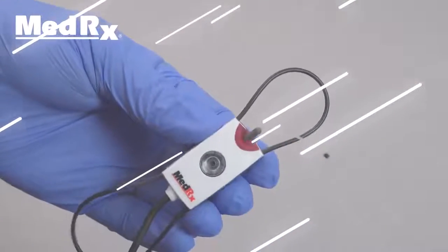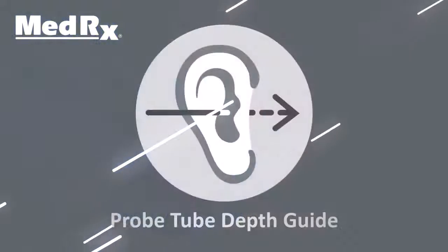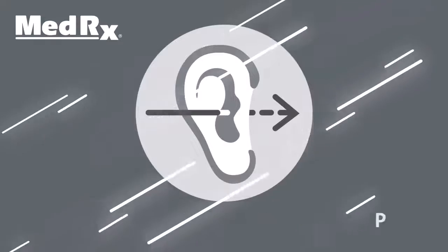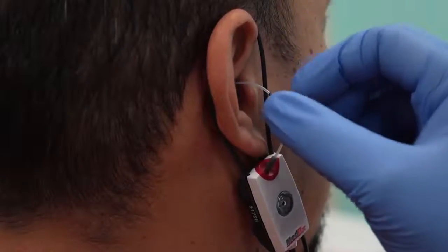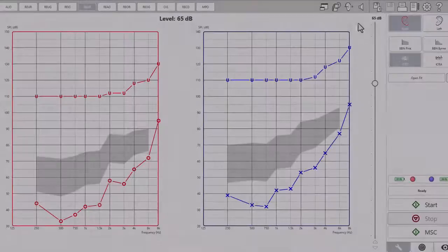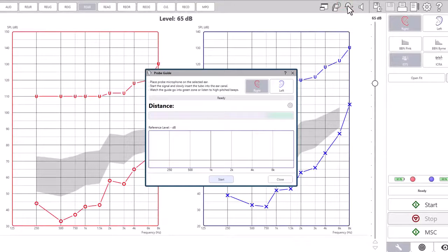In this video, you will see one of our newest features: the probe tube depth guide. The probe guide feature can be accessed in REM and LSM modules from the top toolbar icon or by using the F6 keyboard shortcut.